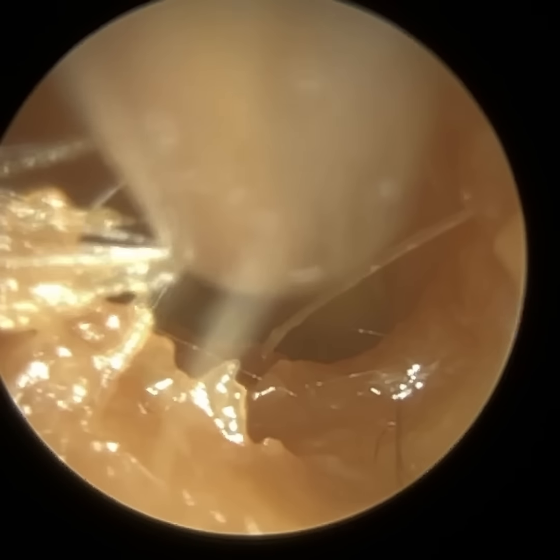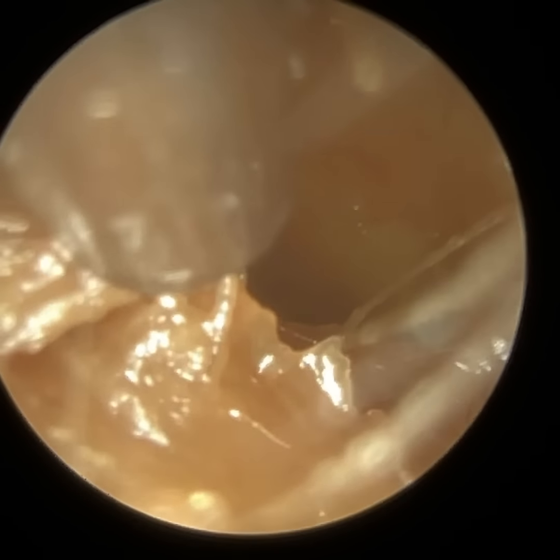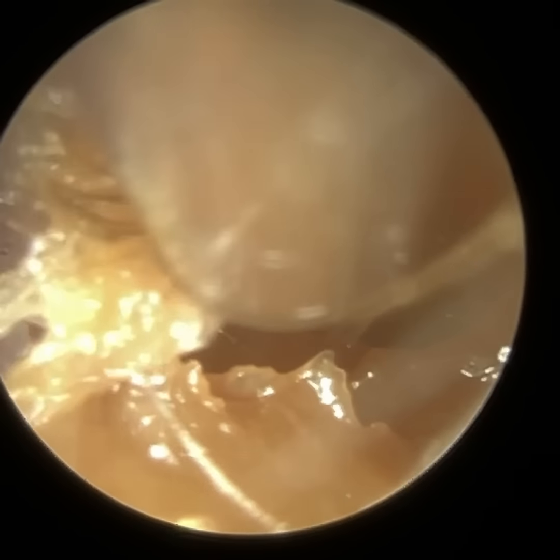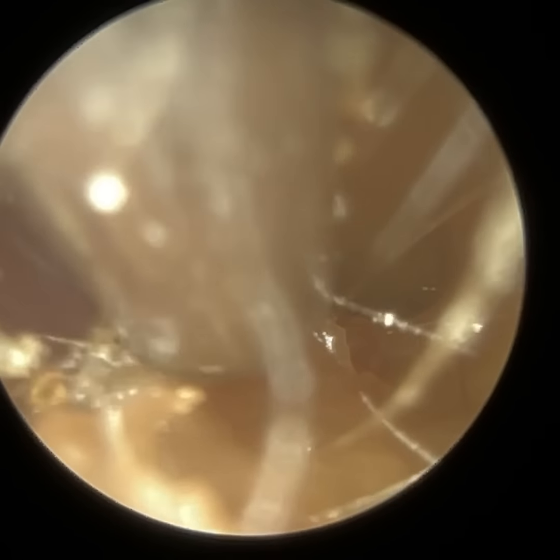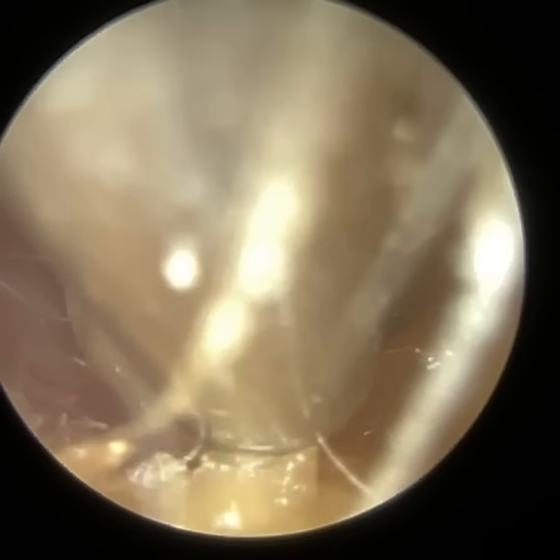So this patient did have their wax removed elsewhere, but they had a sort of residual skin that's become quite macerated and soft because the patient's been using a lot of drops. So what we're going to do now is just perform a skin peel, and you can see the fresher skin underlying this dead keratin that I'm peeling away.